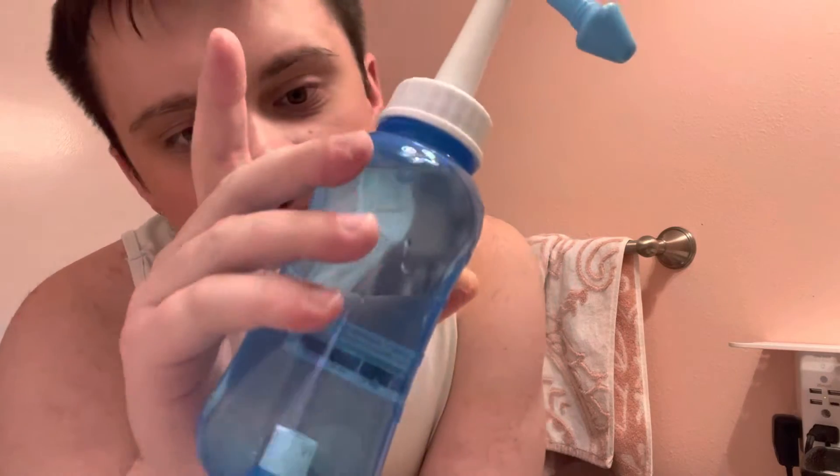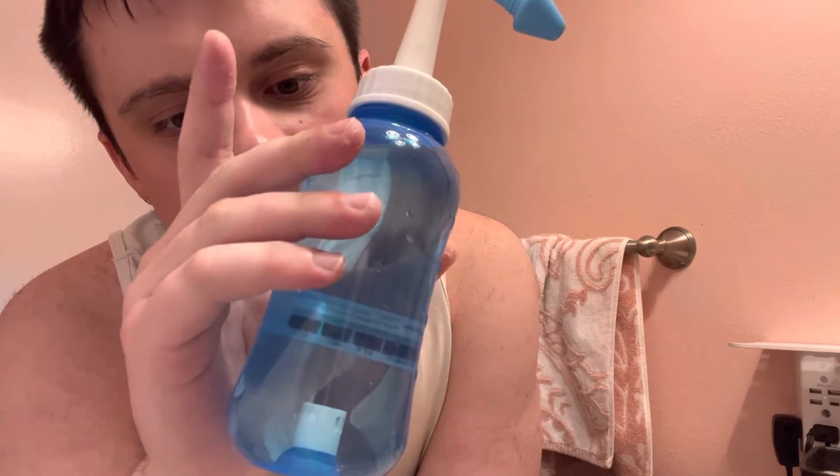It's my first time ever using a neti pot thing. What's this called? The Cyanicare Water Pulse Nasal Rinse Bottle.